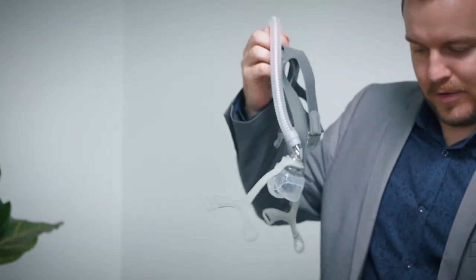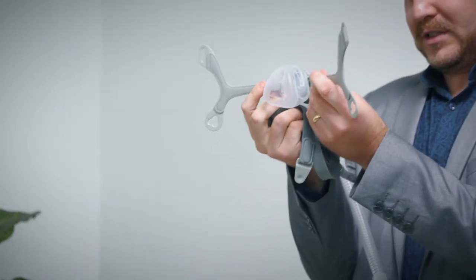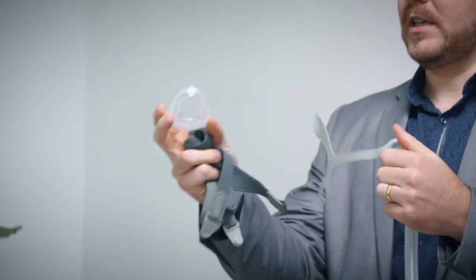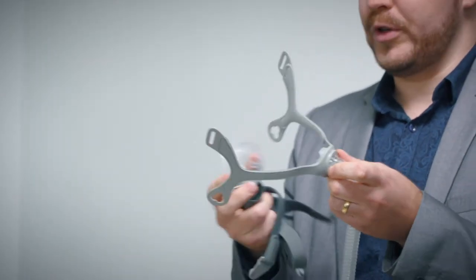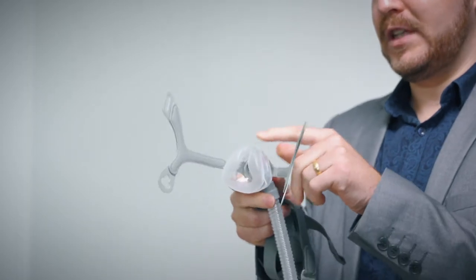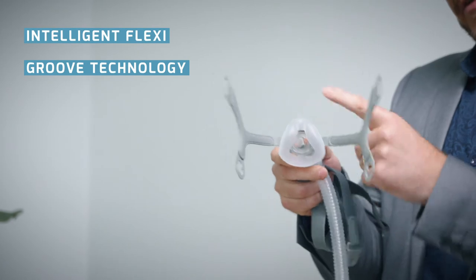Taking it out of the box, you have cheek supports — the mask sits comfortably on either cheek. The cushion on this mask has a resin backing, so it's available in individual sizes or all three cushions, and just clicks on the back like so. This is a flexible groove design, designed to fit comfortably around your nose.